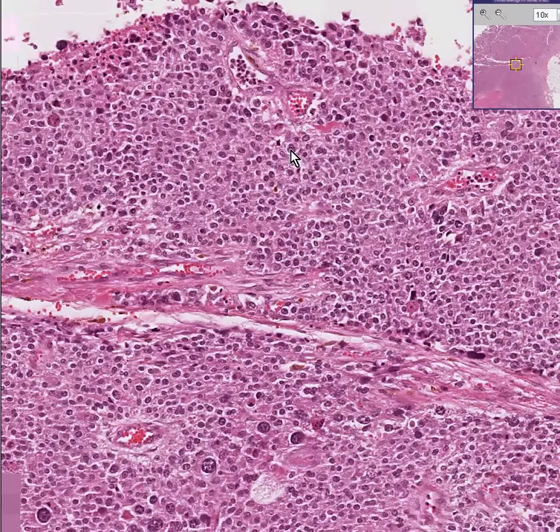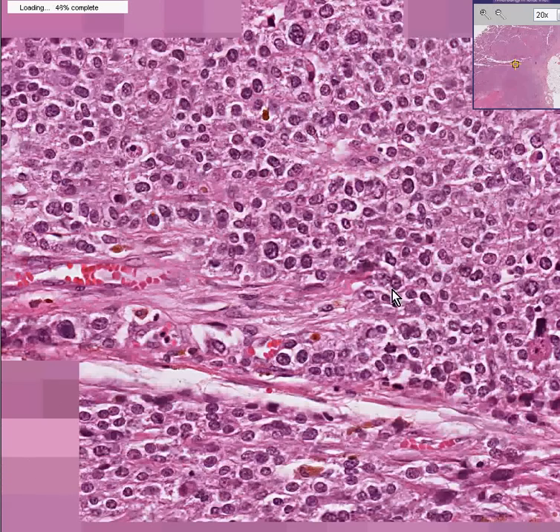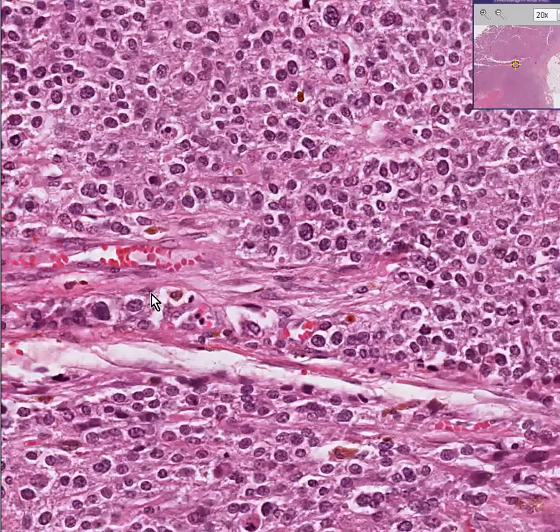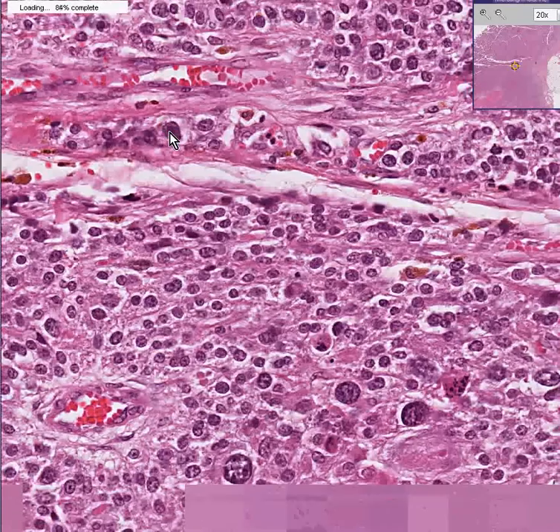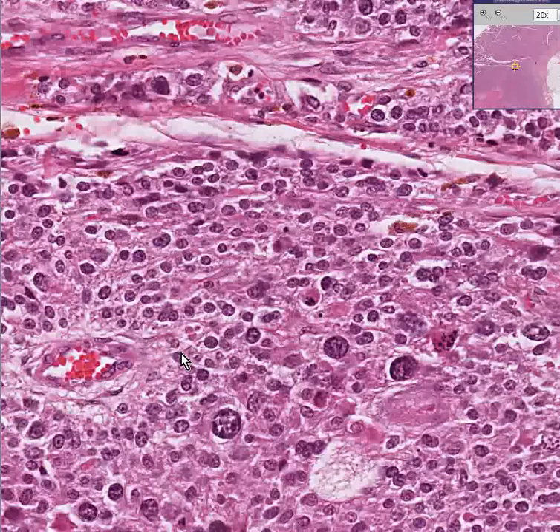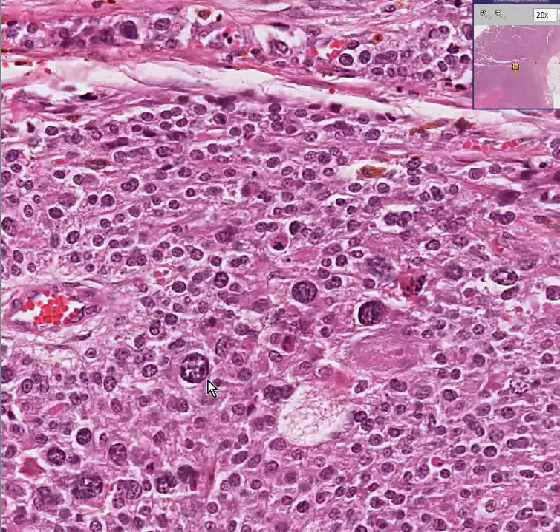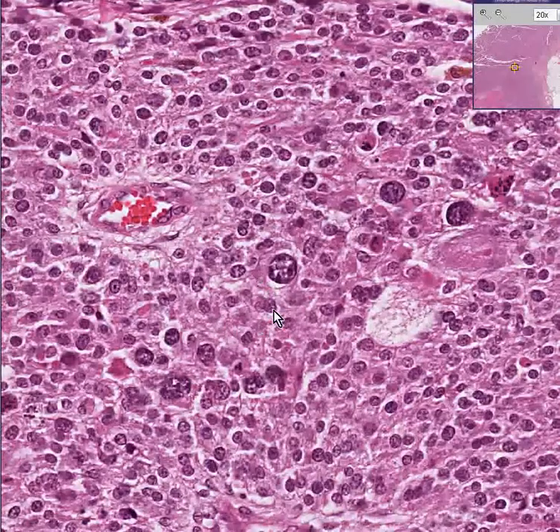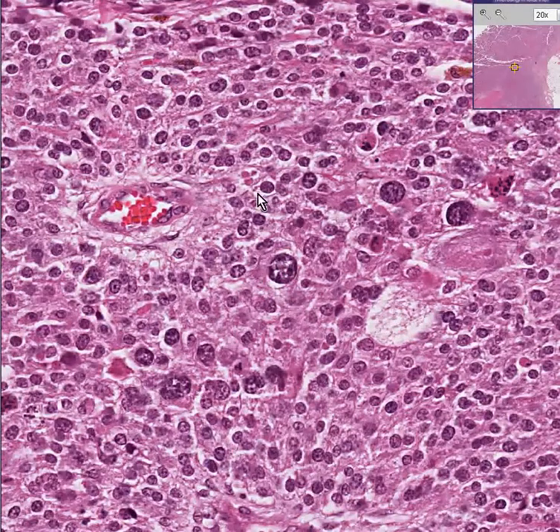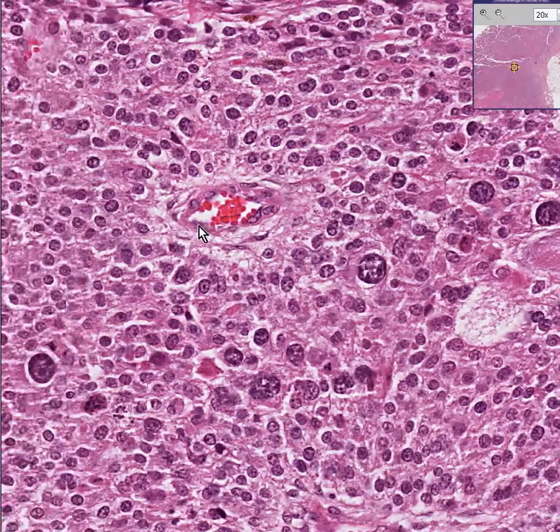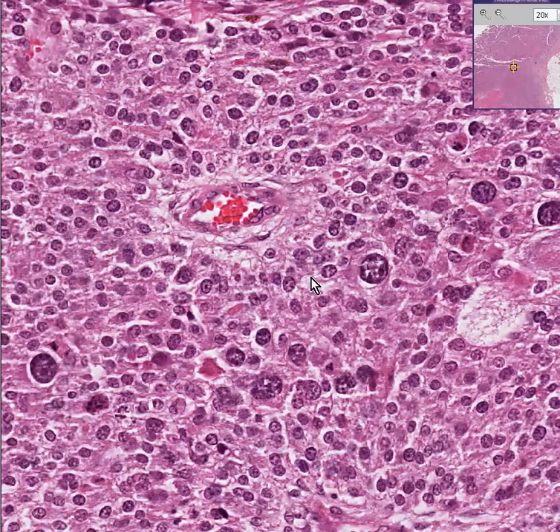First of all, notice that these cells are quite malignant. We'll be using the term pleomorphic, because they are quite variable in size. Also, the term hyperchromatic, where the nuclei take up the hematoxylin dye much darker than some of the other cells. Also, notice that the tumor is very vascular as well — it seems to be filled with abundant blood vessels like this.